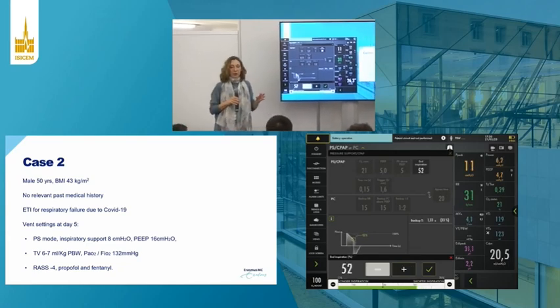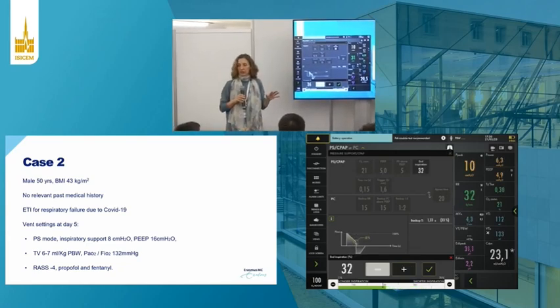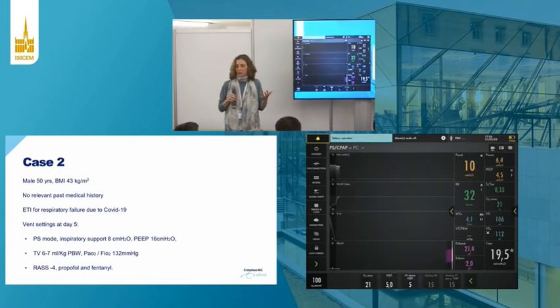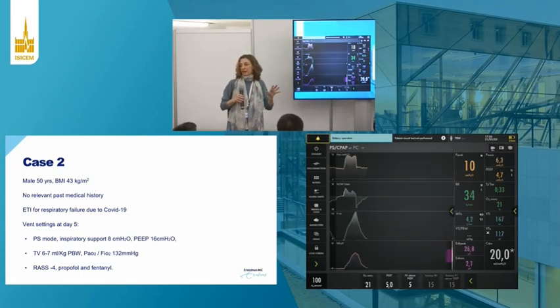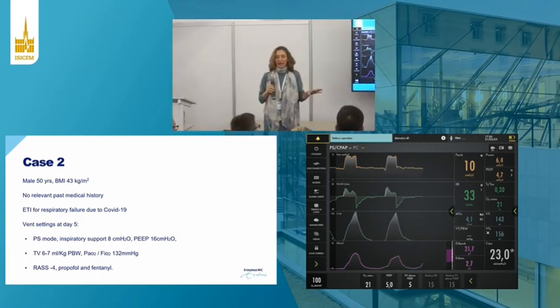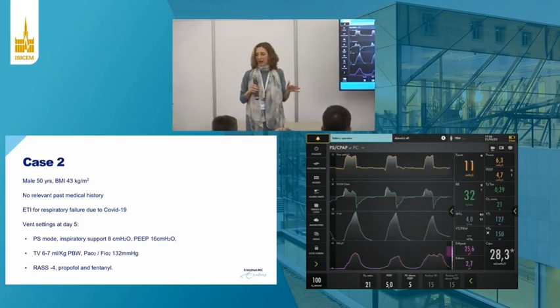Once we identify asynchrony, it's important to solve it, obviously, but you need to remember also that the patient doesn't have a very stable inspiratory time when it's in pressure support. I mean, you can fix it now, but that doesn't mean that if you never see the patient again throughout the night, the next morning everything will be fine.